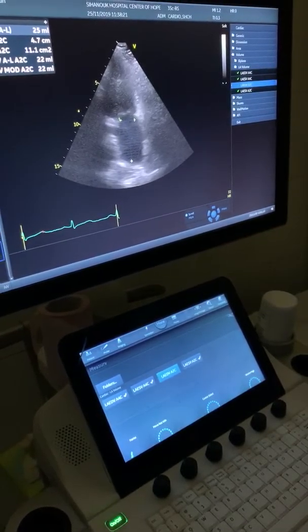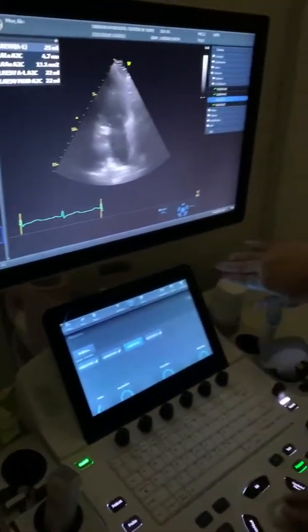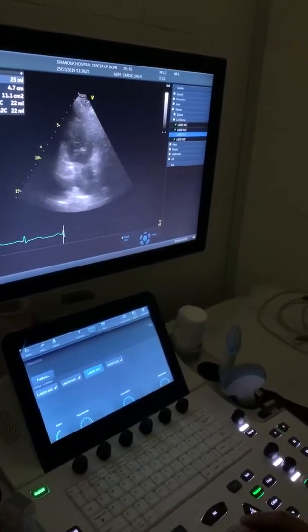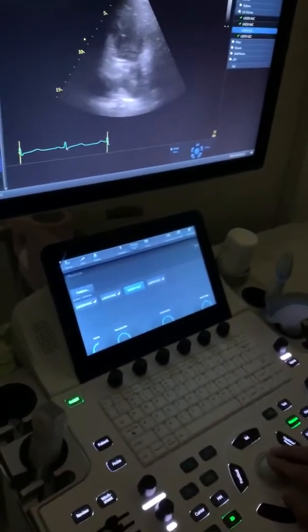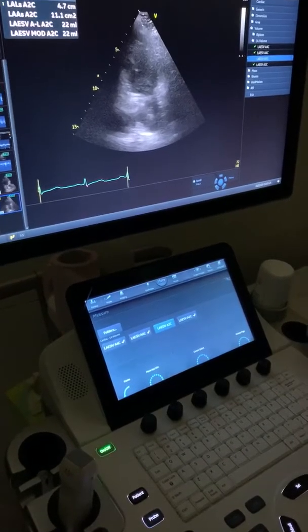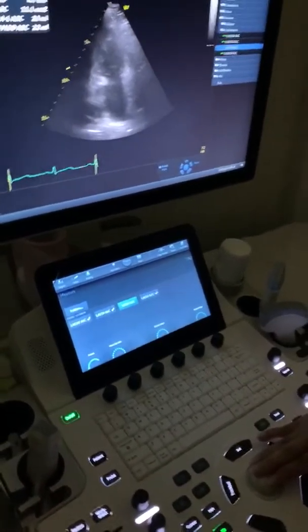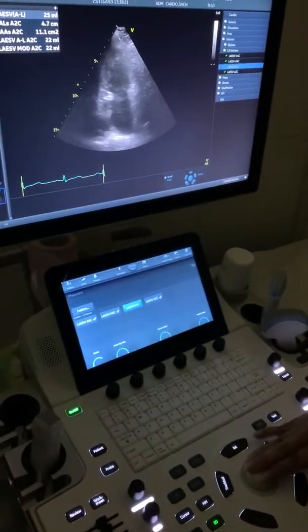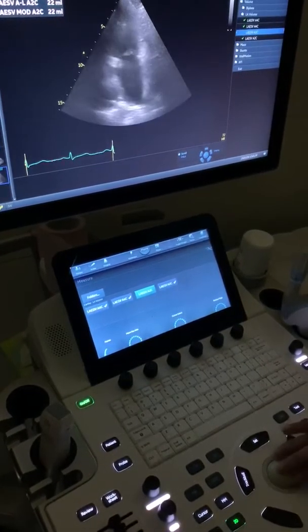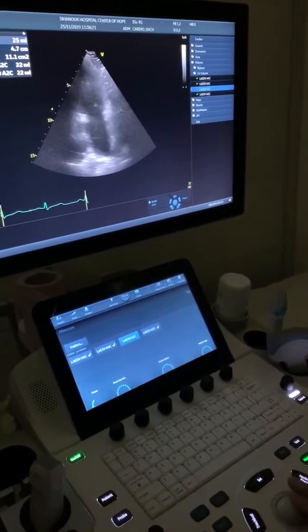So is it correct or not correct? This is starting to be your. Okay. One more. Same time. But here it is open already. Yeah, that's open already. Same as, yeah, systole. That's systole. Measure. I'm going to go for the chamber. LA volume. Systole.